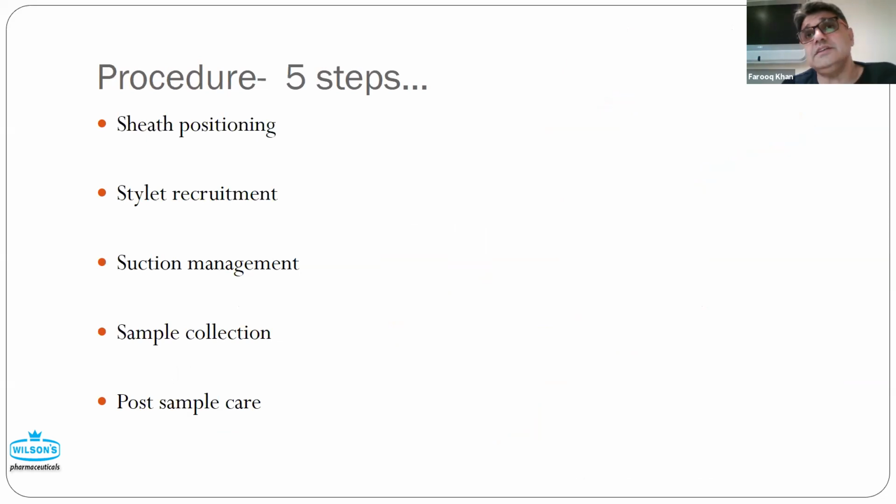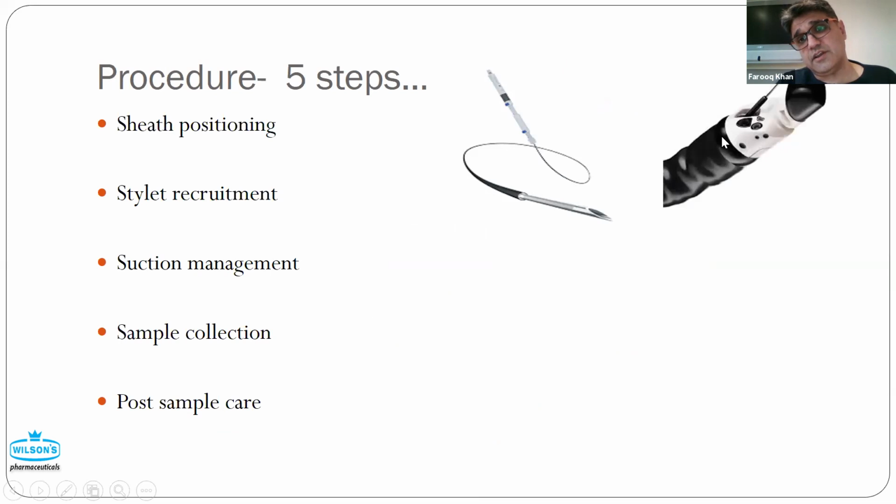When we start teaching EUS to our trainees or on courses, we mention this 5-step technique for starting the procedure from the node. The first thing we tell them about is the sheath and the needle. The sheath should actually be at 0, with no needle sticking out. I wanted to show you that image. If you see the sheath coming out of the scope, that's the safety of the scope. You should have at least 1 centimeter of the sheath out of the scope, and then you can manipulate. I've got a video to show you next.